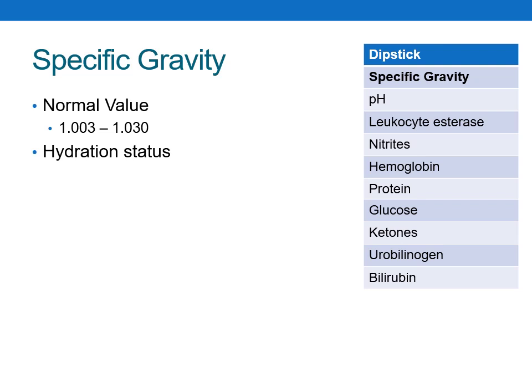So if you happen to notice that a patient is getting a repeated specific gravity level of 1.010, this might indicate that a patient has intrinsic renal insufficiency, given that the specific gravity of the glomerular filtrate is 1.010. So this does happen to be within that normal value, but that will be a consistent number over time.